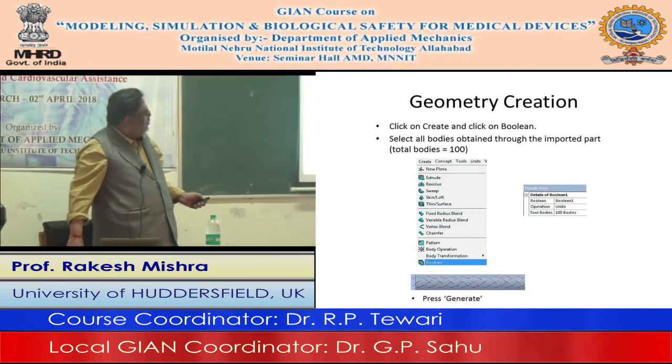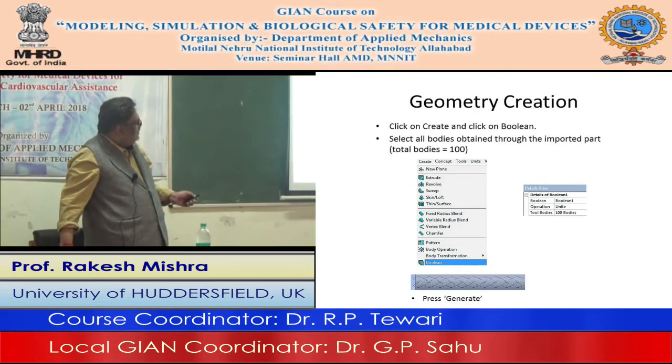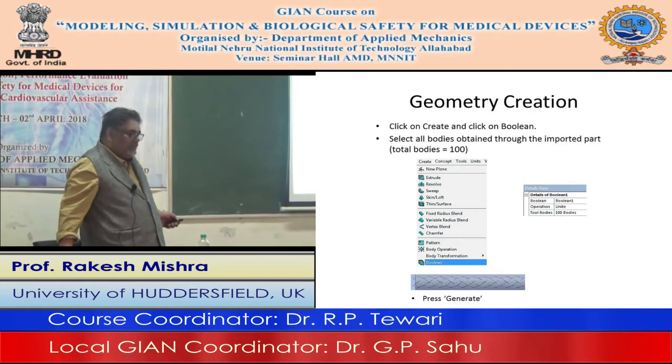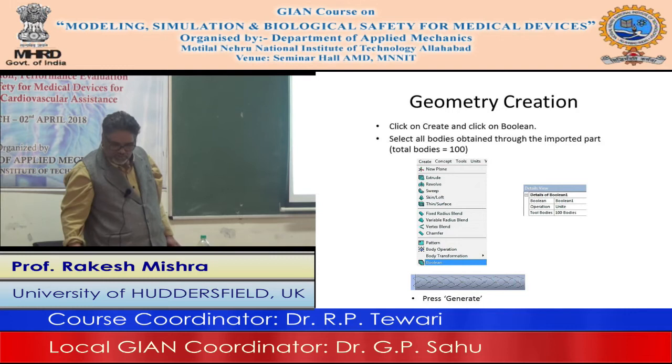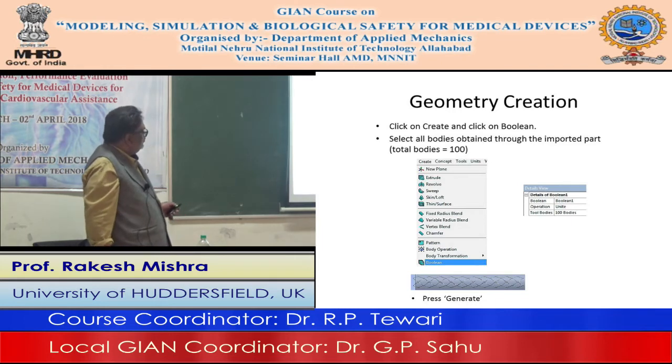Now what we do is, after we have brought it into the system, we carry out a Boolean operation and unite this geometry with the artery. So we have to unite this so that it becomes one geometry. So you don't subtract, you unite it initially so that it becomes one. After that we transform it. So we go to body transformation and we rotate it.